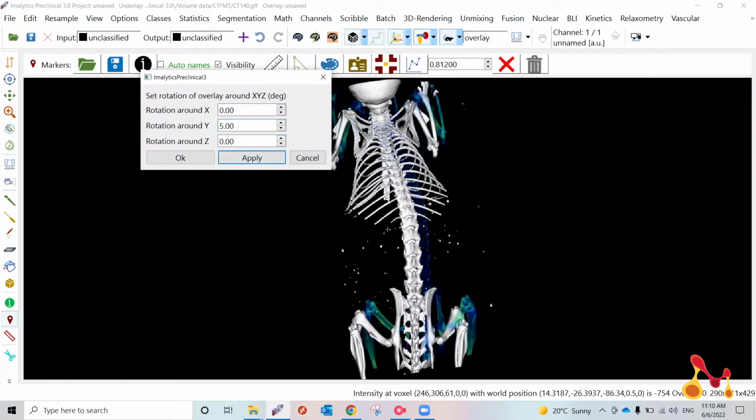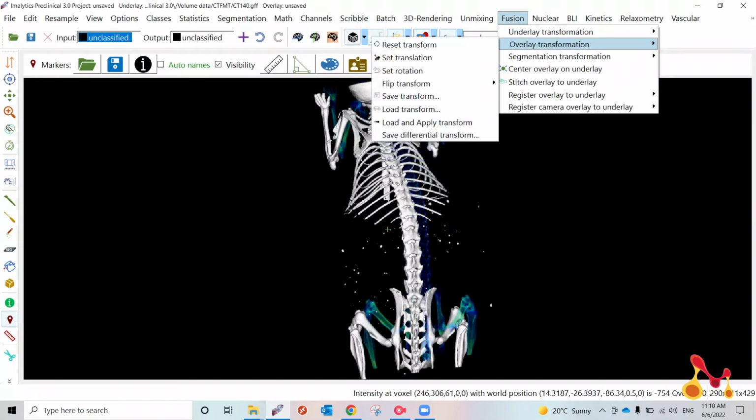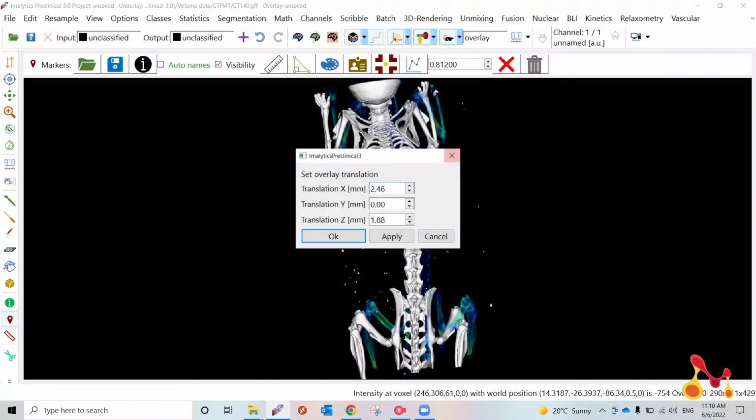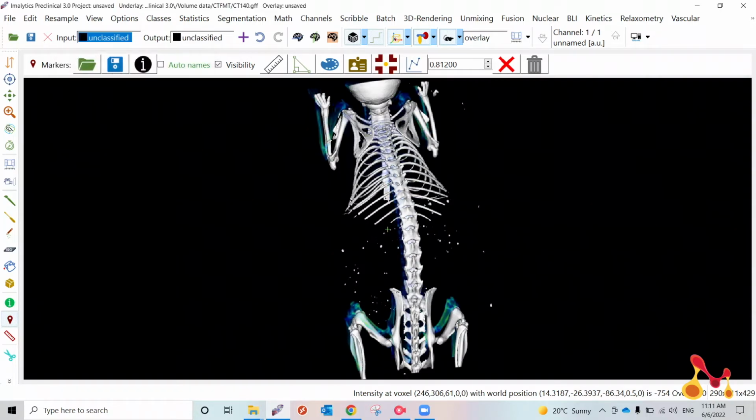That's a little bit better, but we can see now that we need to perform another translation. So we can do this. And what's really nice is that it computes the actual transformations we've done so far from our 0 point. So we'd want to actually do maybe a negative 1.46 over here, maybe a bit less. We can do a negative 0.76.